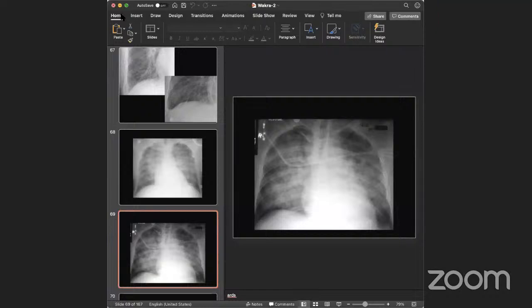Okay, excellent. Thank you very much. I think Dr. Maqsood has made a suggestion about explaining how to read an X-ray methodically. Can you take us through the processes? So I think this is a question to Dr. Abdurrahman. Dr. Abdurrahman, are you around? By the way, if any of the participants hanging around want to ask any questions, just raise your hand and we'll unmute you. Is Dr. Abdurrahman still around?